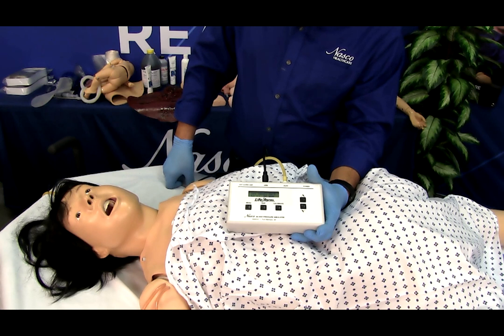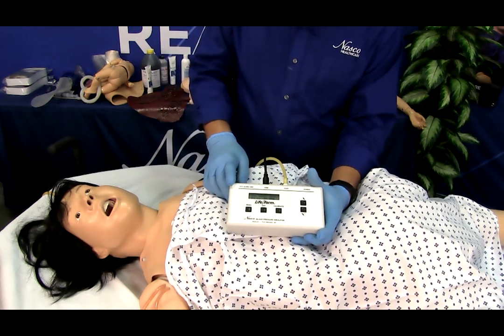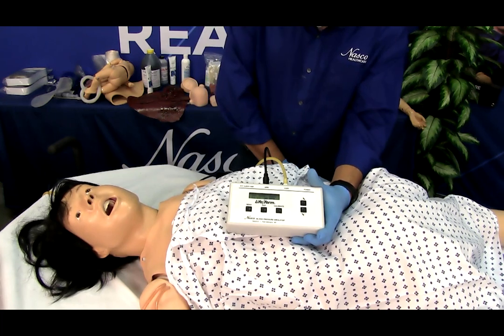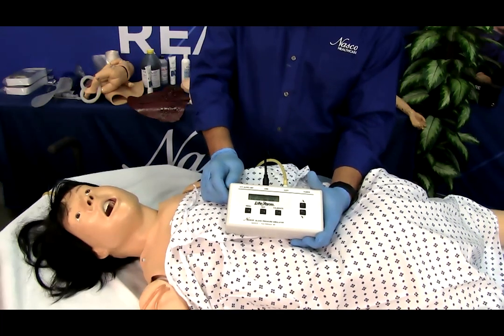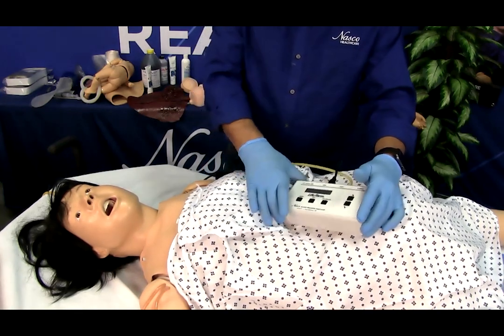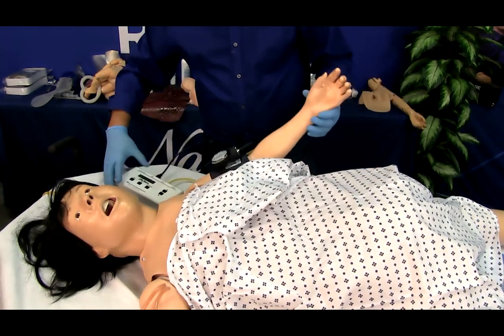To set the palpable pulse, it is found in the radial location. Palpations can be felt upon startup of the unit or after blood pressure and heart rate settings have been made. The palpable pulse is delicate and should be palpated lightly. Pressing too hard will damage the pulse feature. To set the pulse, press the menu key a fourth time.